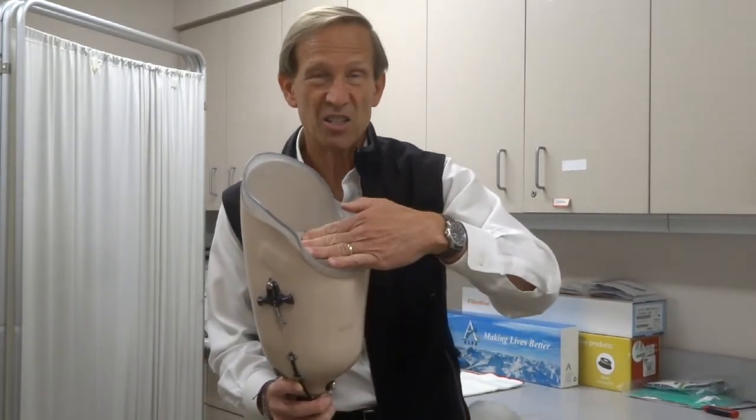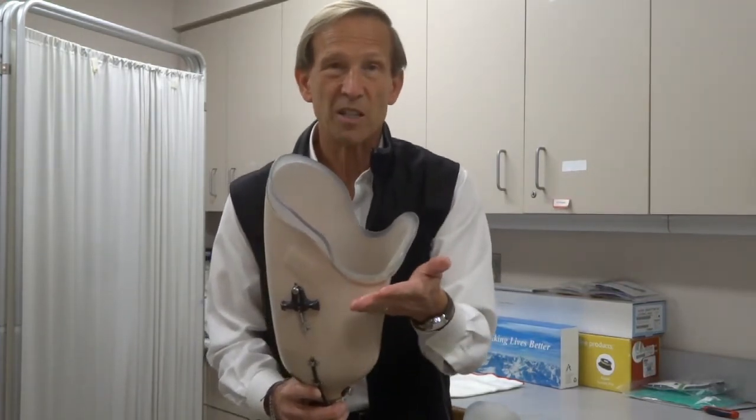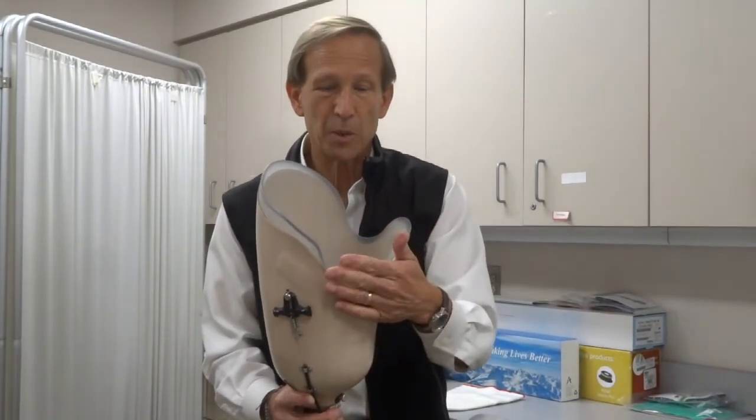We can't trim this too low, because if you make it too low, skin and tissue starts to fall out, and then it rubs underneath and causes more irritation and problems. So we try to bring this inside edge by the groin as high as we can, but then we roll it down and keep it smooth.